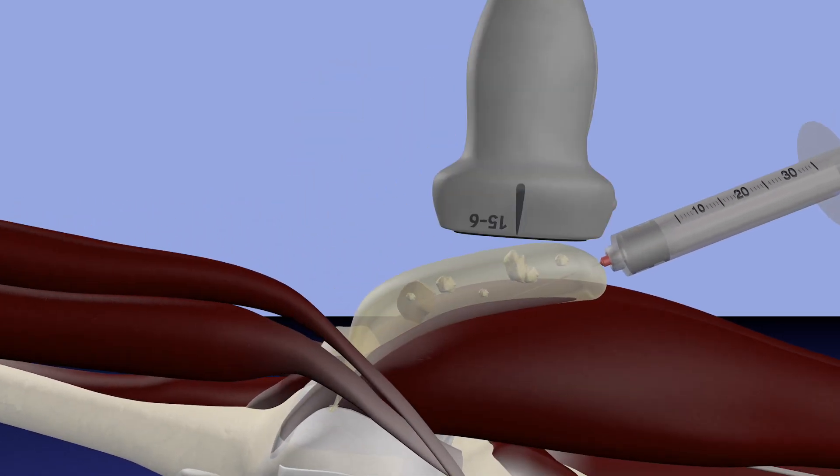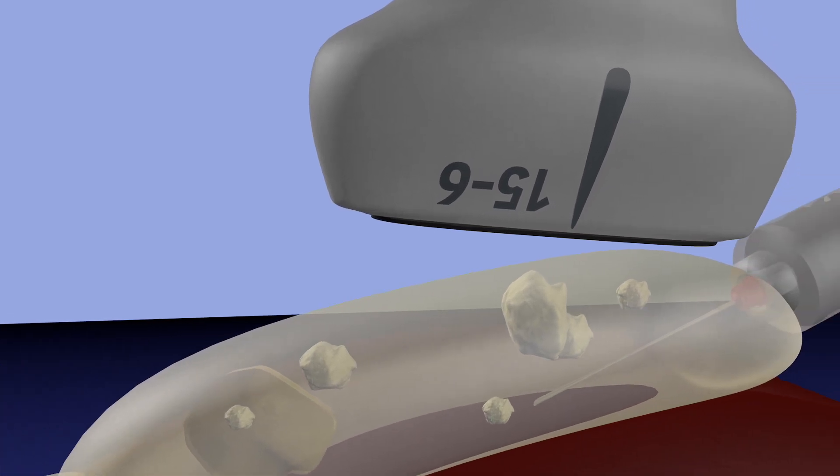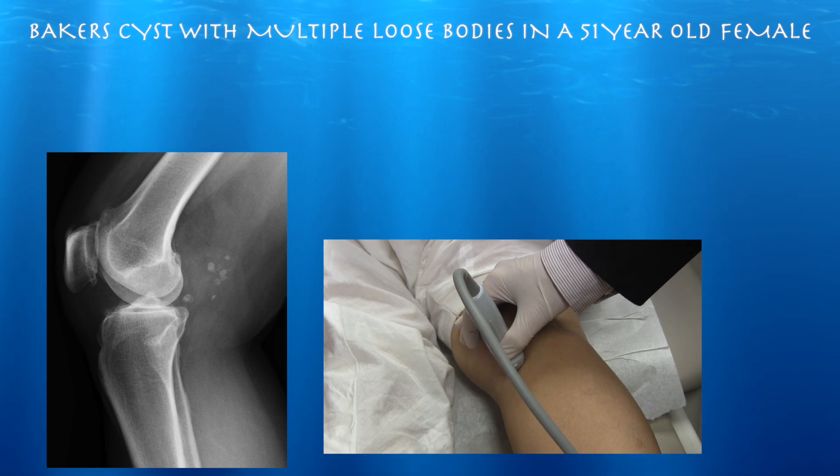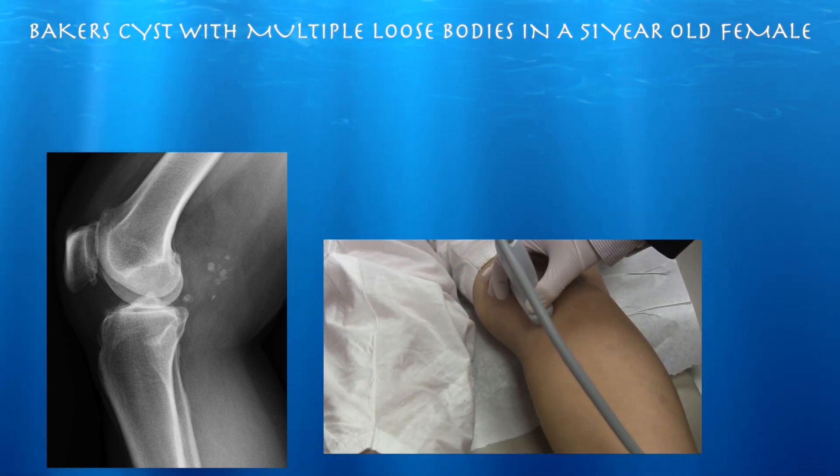Here's our probe position and needle essentially going right into the cyst. In this case, even though we did not advance the needle proximal to the septum, we'll be able to drain the entire cyst. This is a 51-year-old female here for pain in the right knee for about a couple of months, no injury, pain posteriorly. She has a nice Baker's cyst.